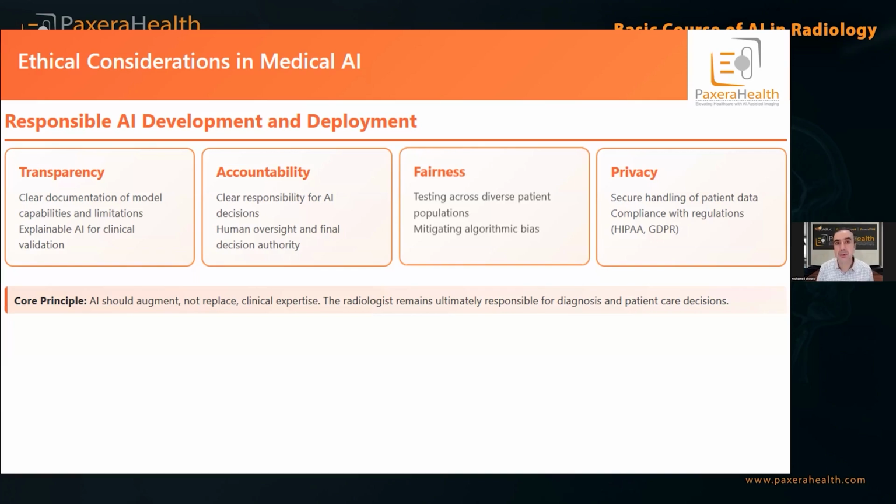Anonymization doesn't mean just removing the patient name. We want to make sure to remove all the PHI, all the protected healthcare information, from the patient. Even if there is a 3D reconstruction and the face would identify who is doing the exam, then we have to change that and make sure that we have a little bit of dithering to the image to prevent identifying the patient. So again, HIPAA and GDPR are very important to consider.